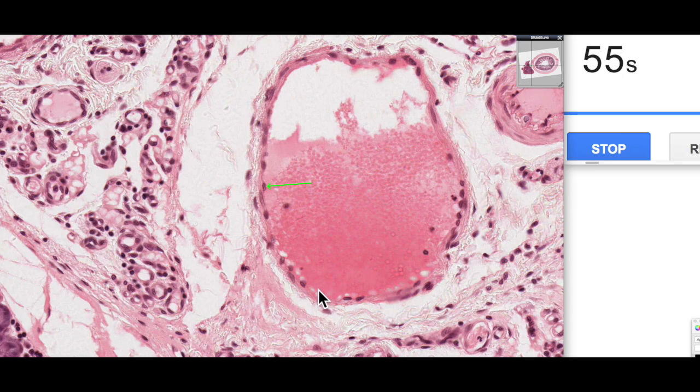This is allowing a frictionless surface so that the blood can pass through without causing any problems, but also here it's also mainly about diffusion. So a barrier of least resistance to allow material to diffuse from the blood vessel lumen to the outer tissues and vice versa. And of course that mainly happens within capillaries, not so much these veins here.